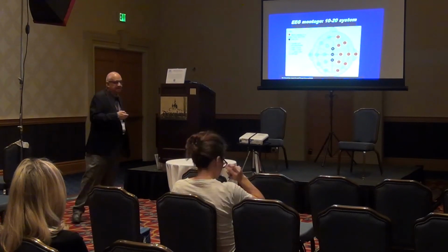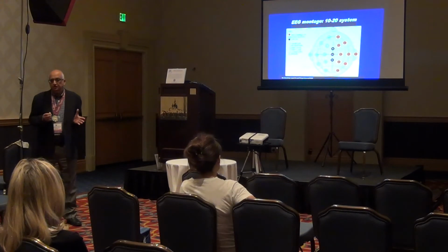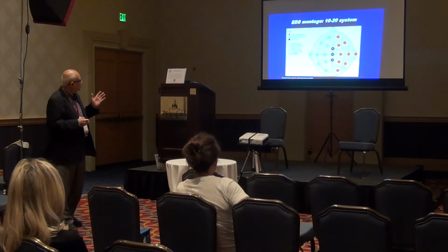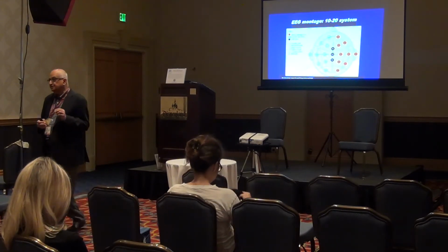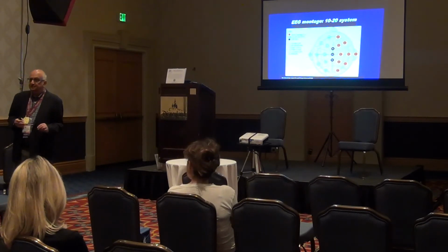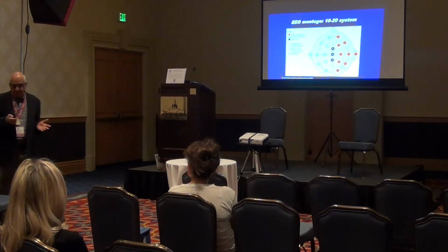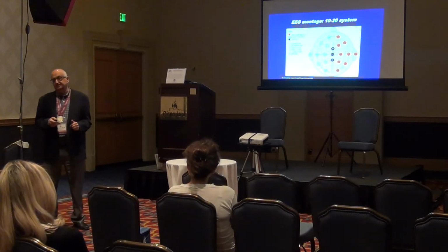So that's basically how the previous lecture, for those of you who attended, they kind of talked about the technology of how they get the electrodes on. What I'm trying to give you is a sense of what we call the 10-20 system. The other term that neurologists often use, they say, I want to see it in a different montage. What do they mean by montage? It's very common epilepsy speak. Montage refers to how those electrodes are connected.